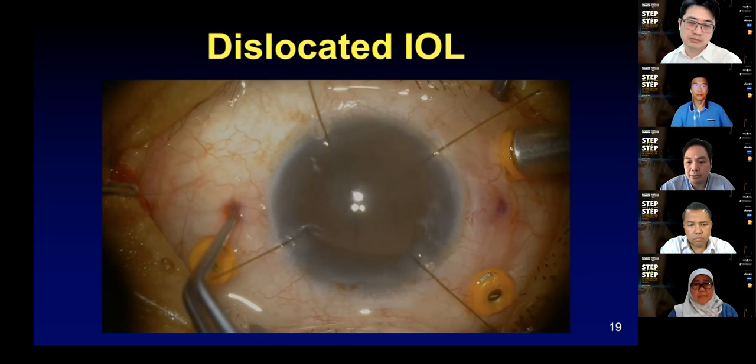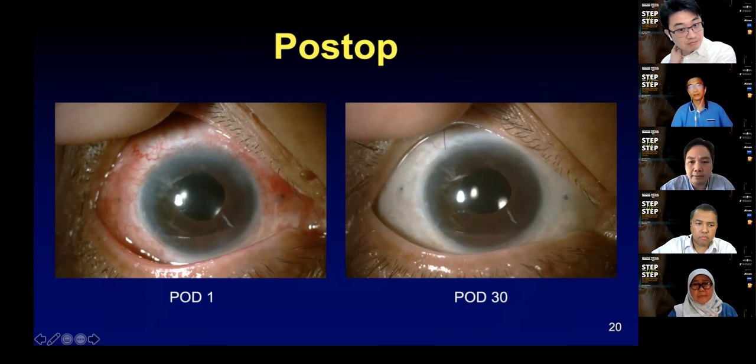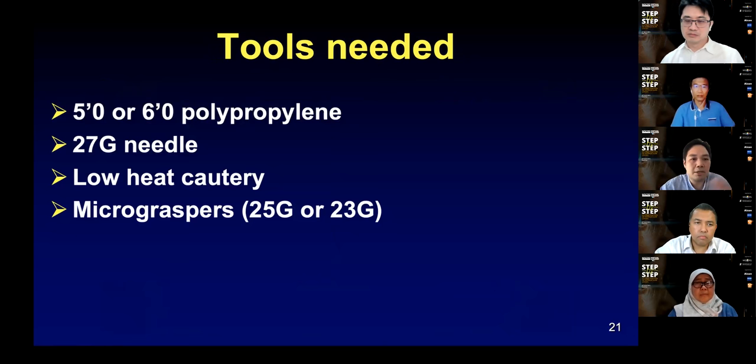The patient I've had so far, about 1 month follow-up, and this is how it looks. So you see those little blue dots there, it's still subconjunctival, it's not come through, the lens looks like it's sitting well. So the tools that we need, as I mentioned, you can use a 5-0 or 6-0. I think 6-0 is preferable. 5-0 might be a bit too big.